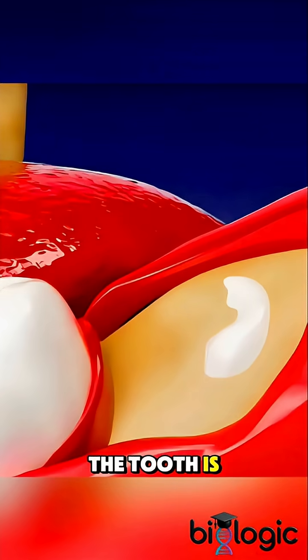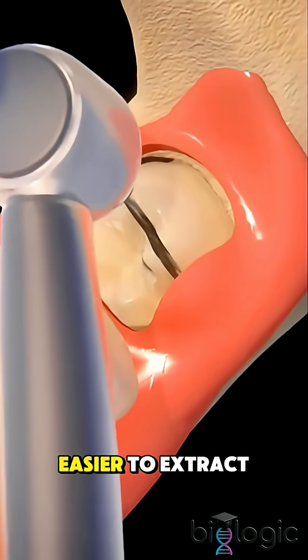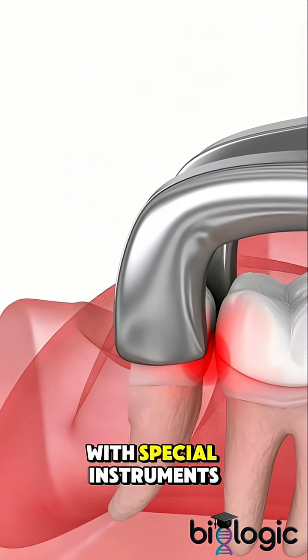Any bone blocking the tooth is carefully removed, and the tooth may be divided into smaller pieces to make it easier to extract. The tooth is then gently lifted out with special instruments.